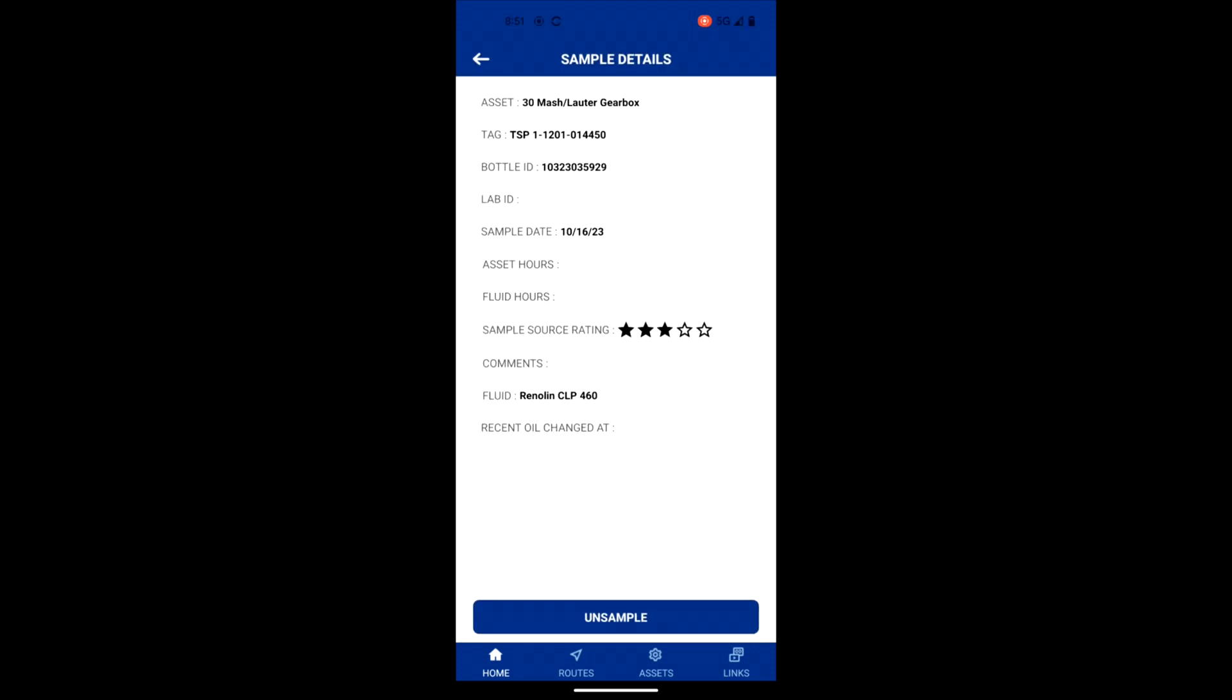To unlink the sample, select the sample, then select unsample at the bottom of the screen.